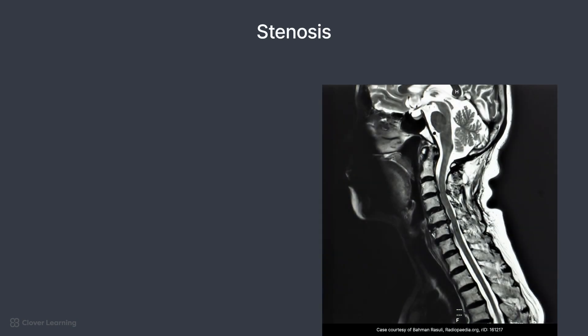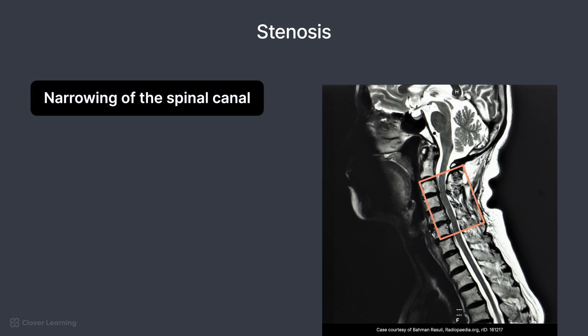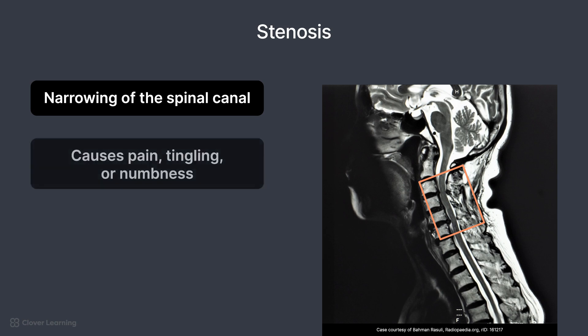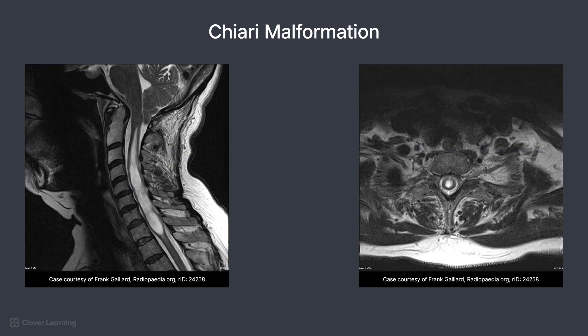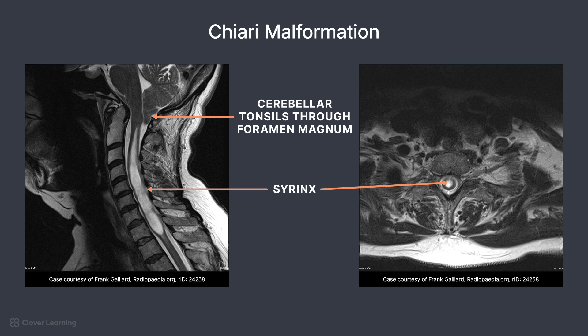Finally, there are pathologies associated with the spinal canal that are important to know. Stenosis is a pathology a technologist would routinely see — this is a narrowing of the spinal canal which puts pressure on the spinal nerves and can result in pain, tingling, or numbness. On a T2-weighted image, this will appear as a reduced amount or narrowing of CSF in the areas around the stenosis. A Chiari malformation occurs when the cerebellar tonsils protrude through the foramen magnum. A secondary pathology is the syrinx — a hollow tube formed in the spinal cord that fills with CSF fluid.